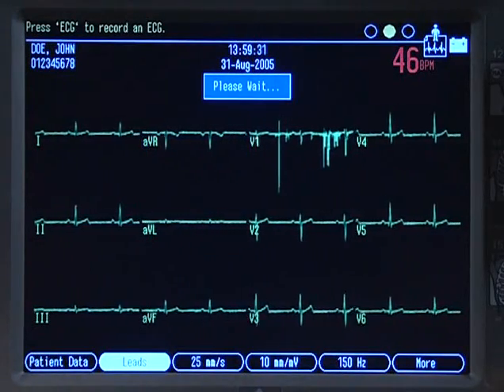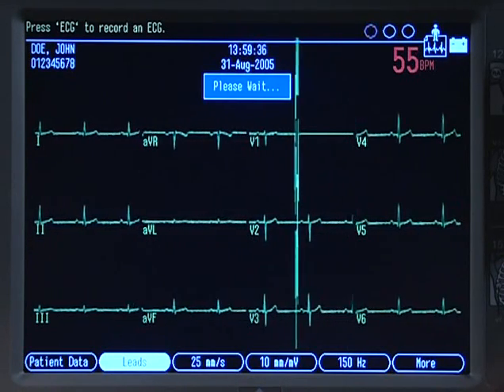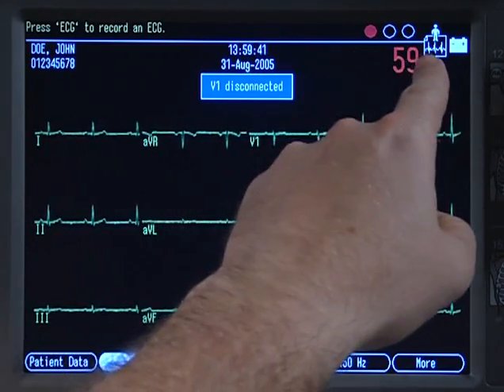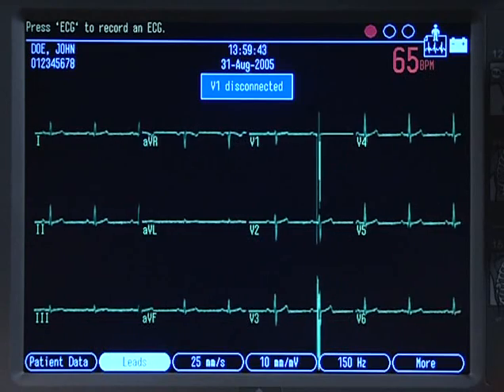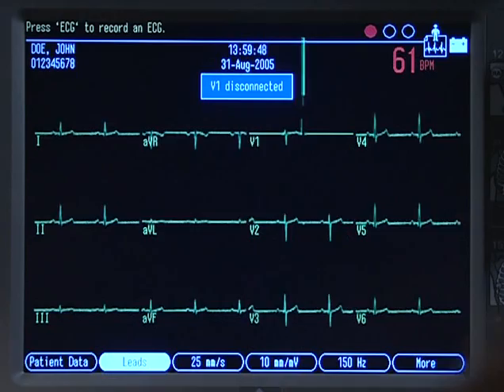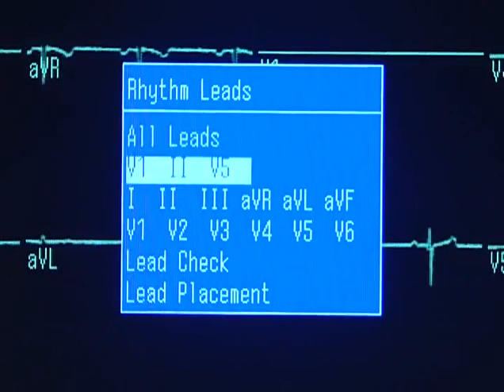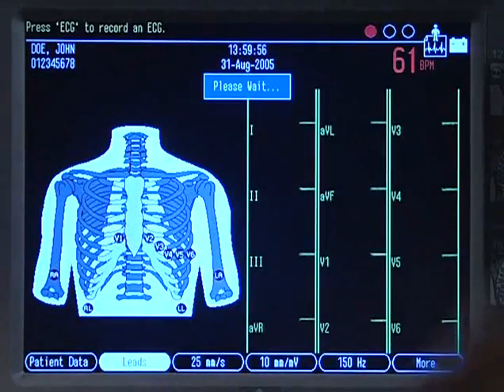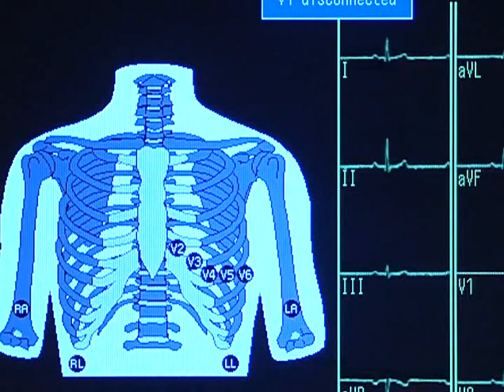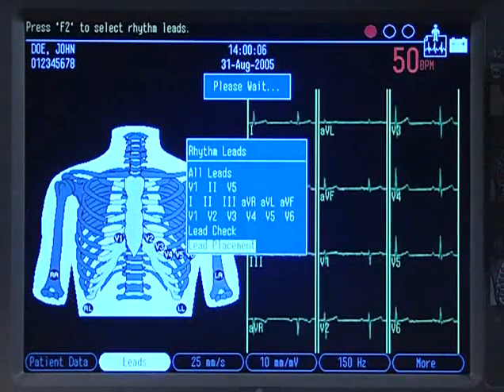You've prepped the patient and connected the leads, so it's time to record an ECG. First, look at the hookup advisor to verify wave quality and make adjustments to your hookup if needed. If you see artifact in addition to the hookup advisor, you can press F2 to bring up the lead selection screen. Then choose lead placement to see a visual representation of the torso with lead placement. Those leads that are bad or poorly connected will flash, so you'll know which to adjust. Press F2 again and choose all leads to return to the original screen.